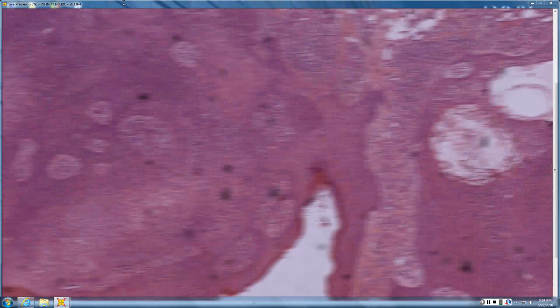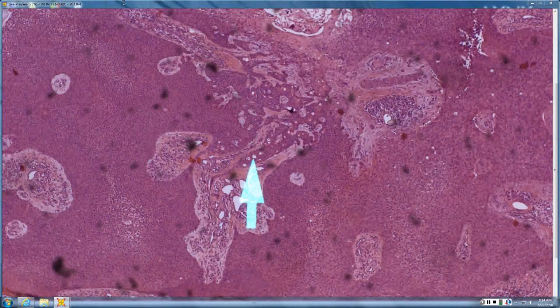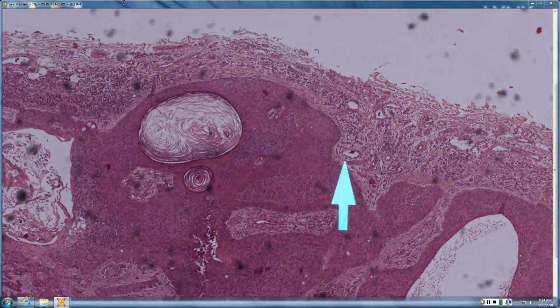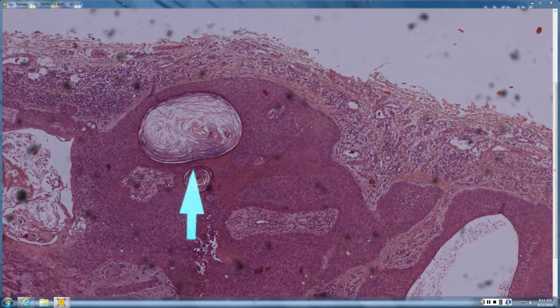What sort of acrospiroma look does it have? It's certainly a pink tumor with ducts. Blue with ducts is sebaceous. Pink with ducts is acrospiroma group. A lot of these islands are embedded within the surface epidermis, and there happen to be horn cysts.